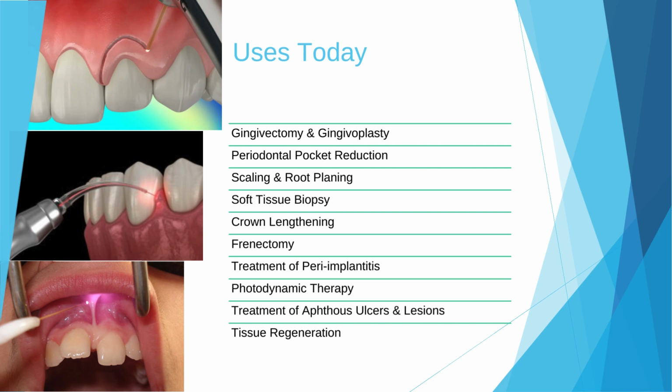Crown lengthening. By removing extra gum tissue, lasers can be used to extend crowns in situations where more of the tooth structure has to be visible for restorative or aesthetic reasons. For example, people with gummy smiles might want to undergo crown lengthening procedures.